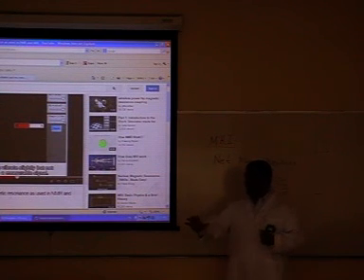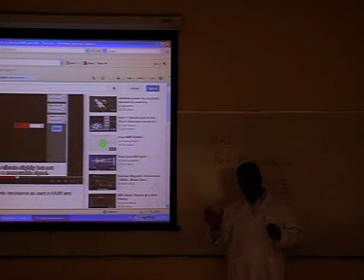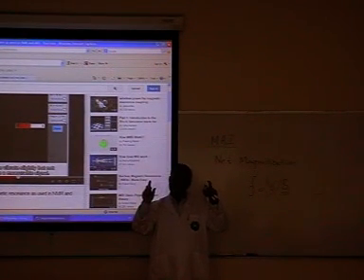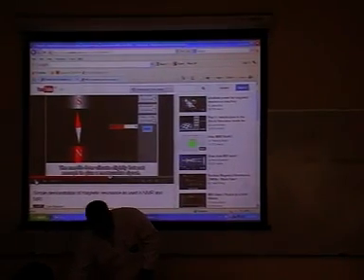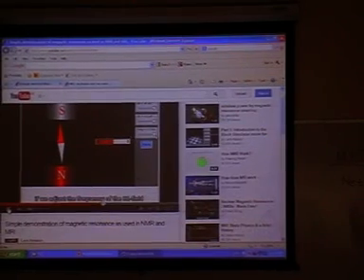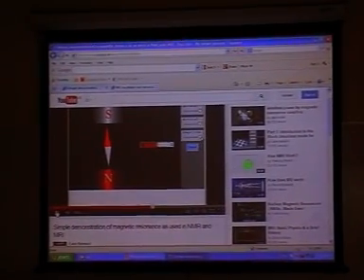At the beginning, the needle was not affected. He just picked some frequency, and you see that the needle oscillates a little bit, but was not affected greatly. But see what happens when he adjusts the frequency so that both frequencies are the same, to give a measurable signal. We can improve the situation much if we adjust the frequency of the B1 field to the natural vibration frequency of the compass needle.